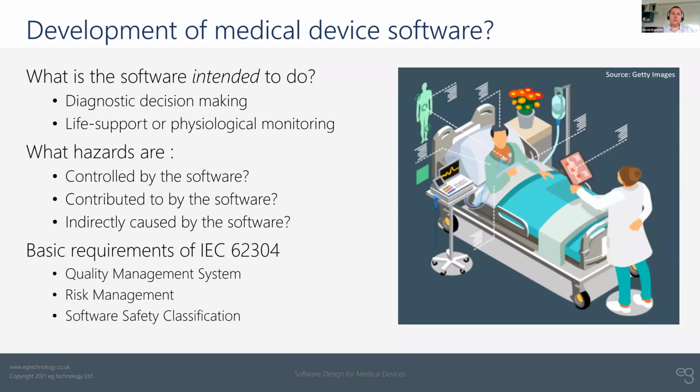So in the EU, that's the MDR or IVDR. The FDA have very similar standards, and globally, depending on the territories that you're looking to enter, there will be some national or regional regulation that sets the requirements to get onto the market.